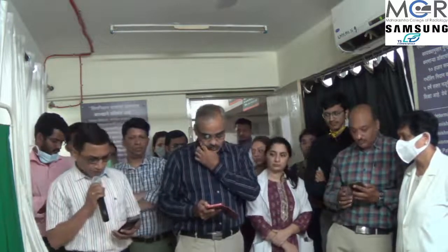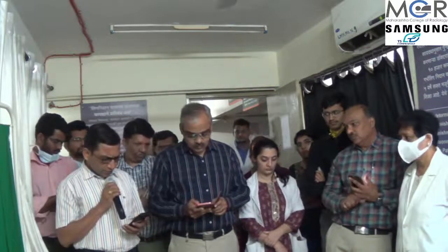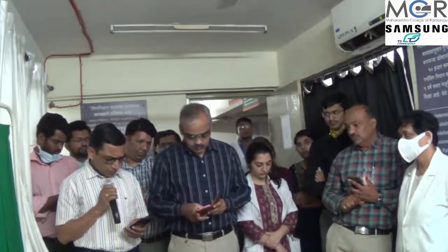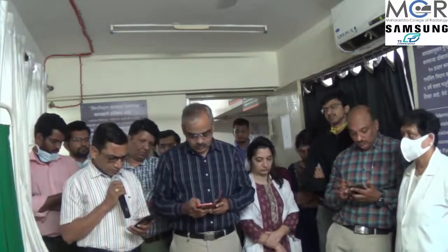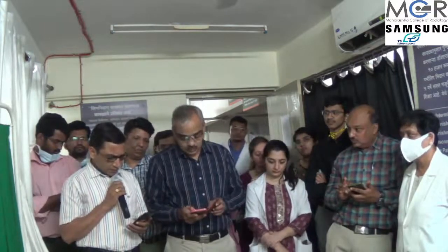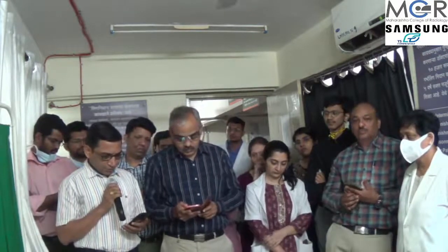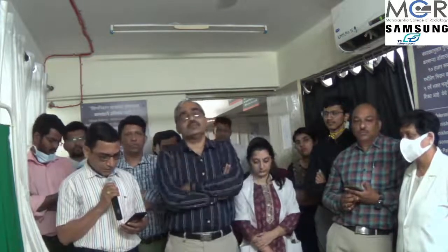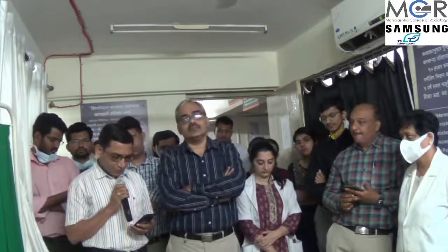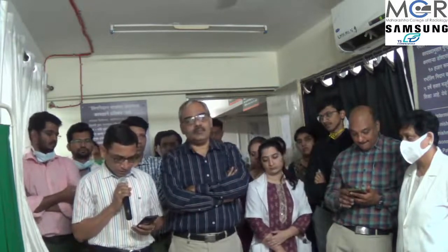There was one more question. Is TVS warranted in every asymptomatic postmenopausal female in whom endometrial thickness and ovaries are not well seen on per abdominal? Is the referring doctor's request needed to convert a transabdominal sonography to TVS? To convert a transabdominal sonography to TVS, it is the patient's consent which is needed, and the consent of the referring doctor is not required. If the patient doesn't give consent, you can't do it, and the doctor has nothing to do with it in such cases.